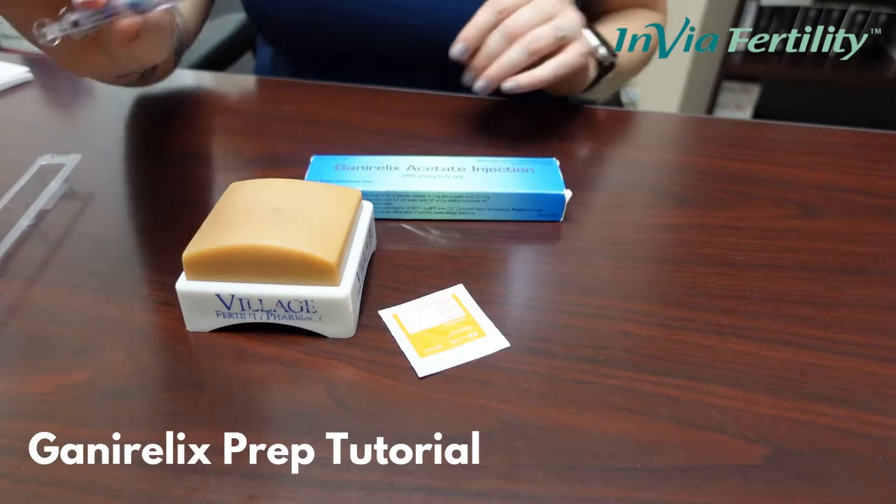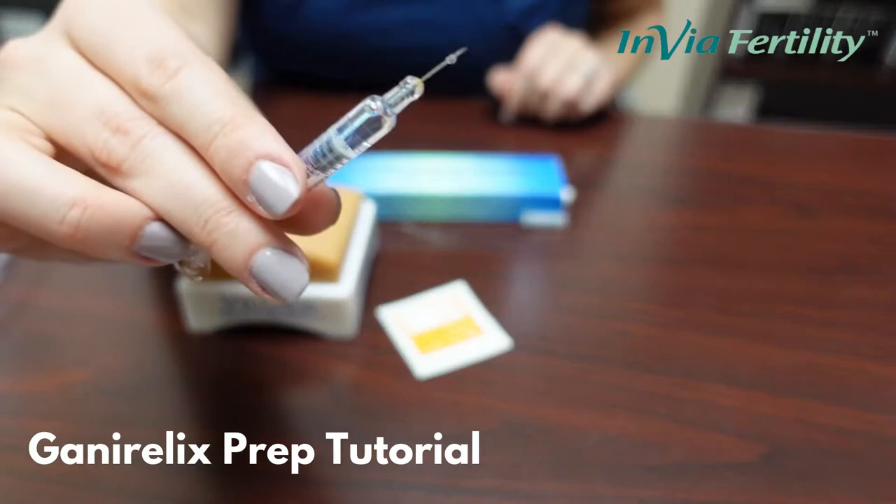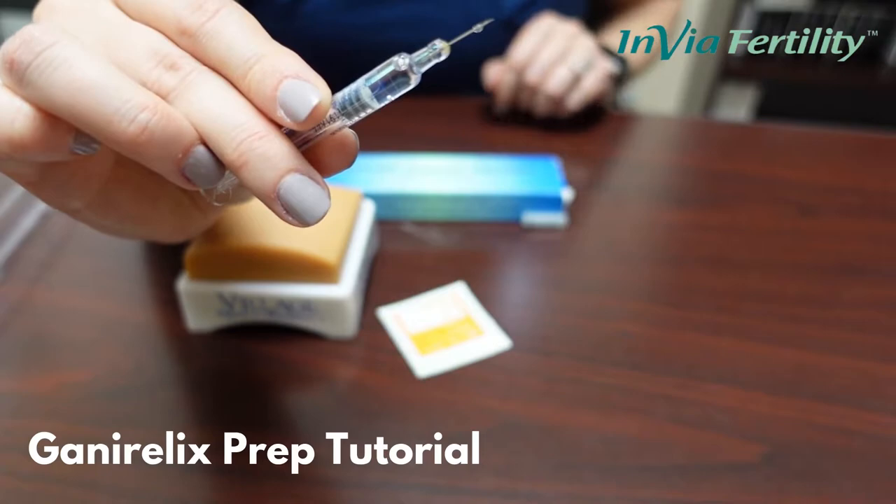Here we have Ganarelix. Inside the box you will find one pre-filled syringe. To use, you will simply remove the cap. There is no need to do any mixing or measuring because it is pre-filled to the appropriate dose.